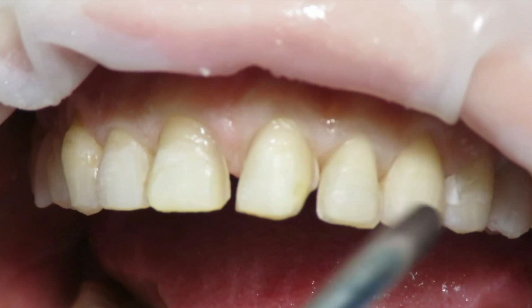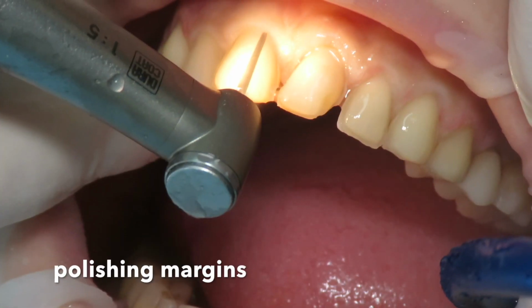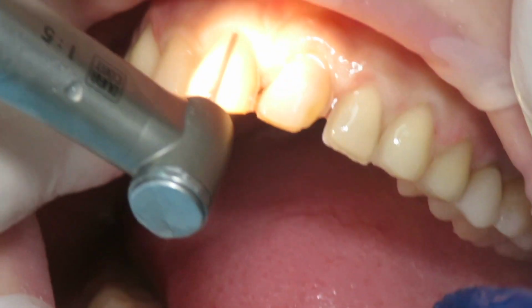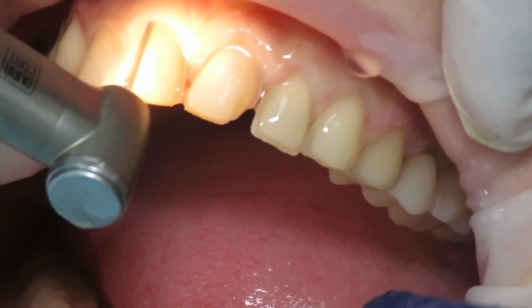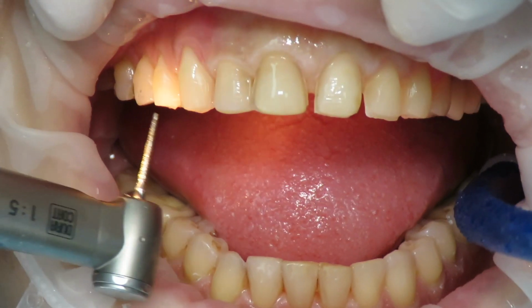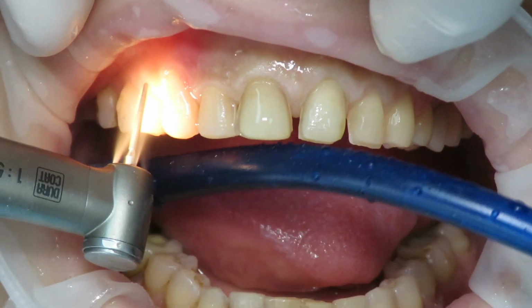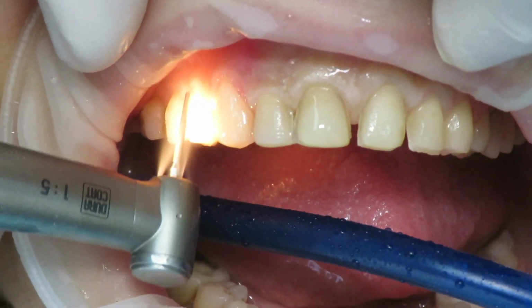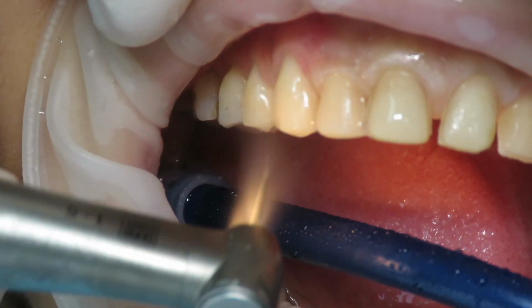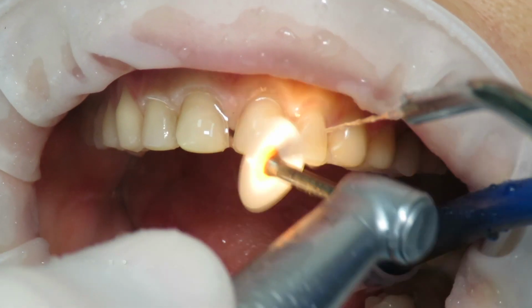So for the polishing of the margin, in this situation we use low speed, high torque, and we use a lot of time. The polishing burrs, the red grip, and we like to use these polishing discs for a little bit of polishing.